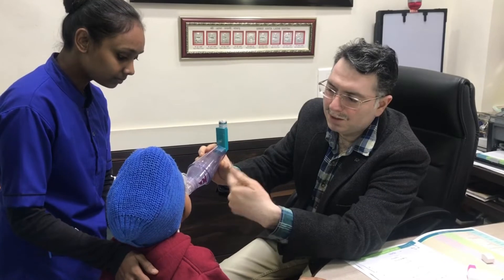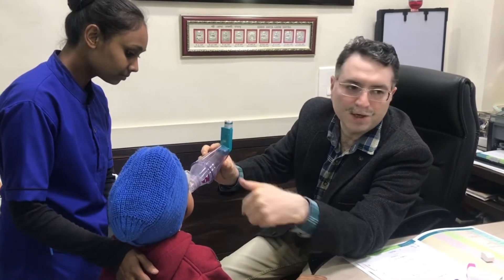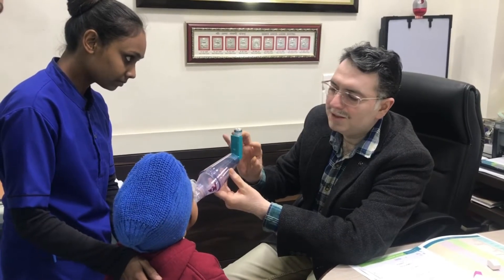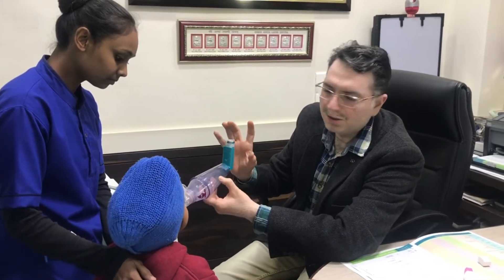When the child's face is covered, the mask is sealed and closed. We have about 30 seconds to keep the face still.